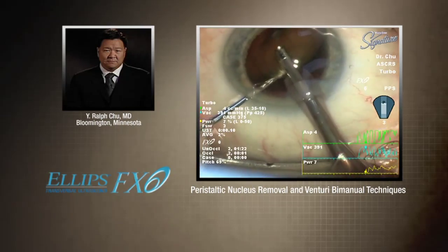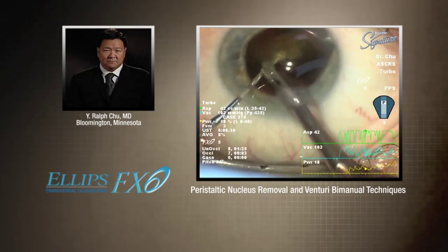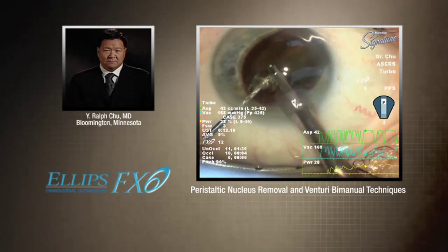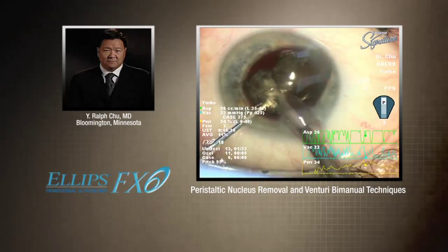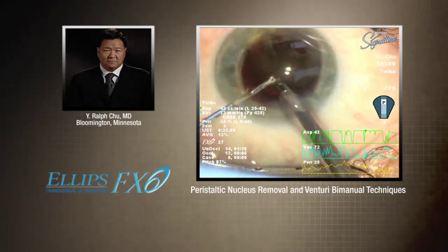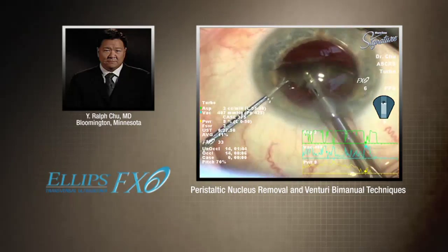What I'm showing here are some new settings that we just tried — these are our first cases with these settings. And this is amazing, because usually the first case you have to adjust to them. But it's all 100% FX, so 100% ellipse. This is showing the case — this is a peristaltic nuclear removal. And I prefer Venturi bimanual, so I switch on the fly within the surgery. You can see I floated the nucleus out, and we've already removed half of the nuclear material supercapsularly in a fairly short timeframe.